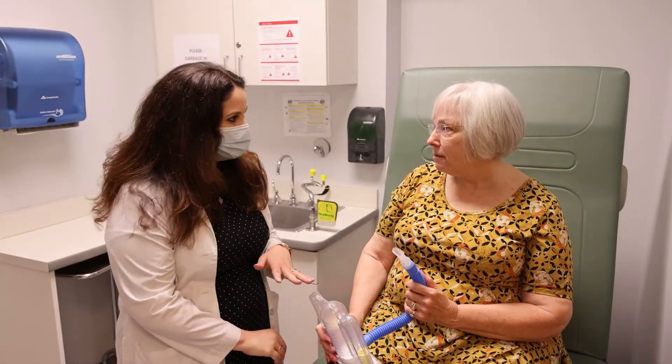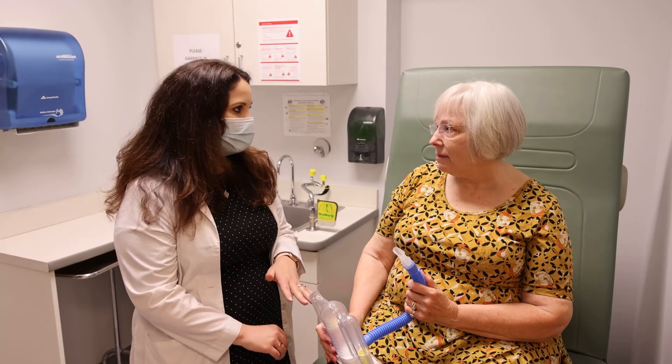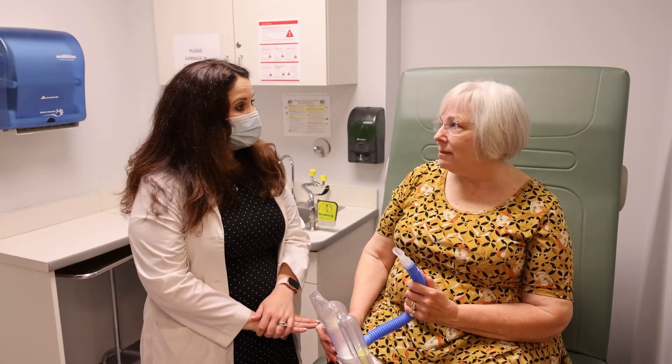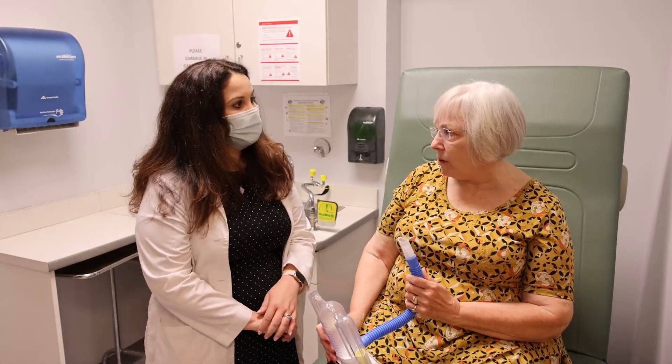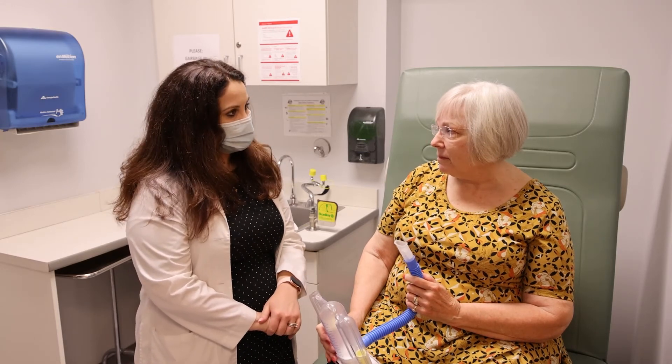After surgery, you're going to be asked to use the incentive spirometer ten times an hour, every hour, while you're awake to help prevent pneumonia. Don't be surprised — it's going to be a bit harder for you after surgery due to anesthesia and pain. But as you get stronger and as you recover, you'll notice that this gets easier and easier.